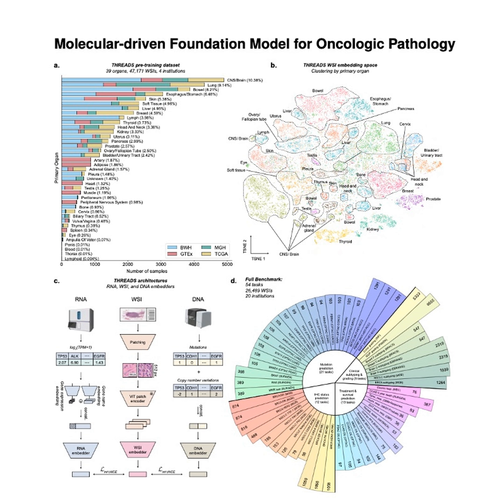And the takeaway there is pretty significant for the field. It suggests that a really smart, biologically guided pre-training strategy using diverse multimodal data might be far more effective than just brute forcing things by scaling up the raw size of the AI model. Smarter training beats bigger models, perhaps. Quality over quantity, in a sense.